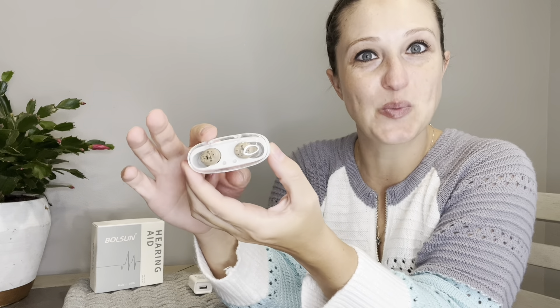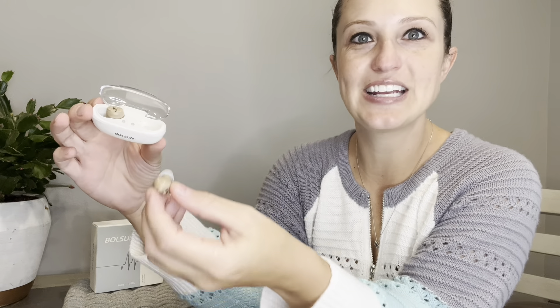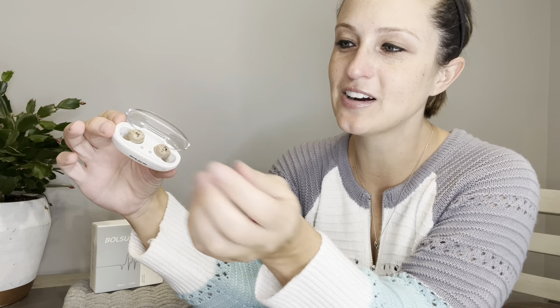Our hearing aids will come in a great carrying case with transparent tops, so we can easily see if they're in there or not. On the back is where we will charge them. Inside the hearing case it is magnetic, so you can easily just place them in there and they will line right up and sync with the magnets to charge.